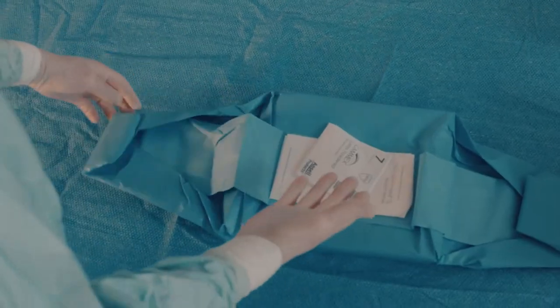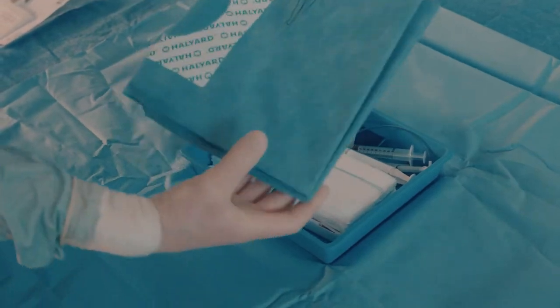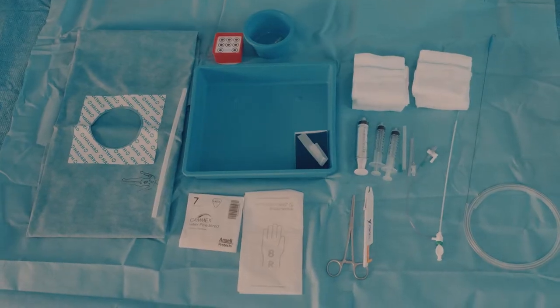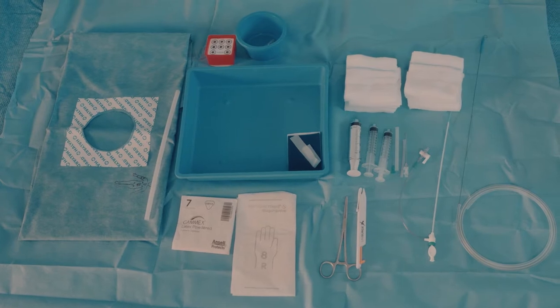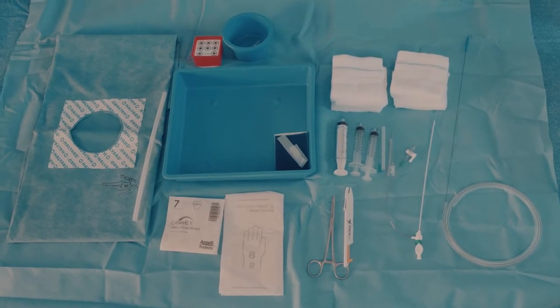Open the package and identify the components: sterile gloves, the sterile dressing to cover the puncture site and the legs, needles, syringes, swabs, introducer, scalpel, needle holder, guide wire, and stopcock.